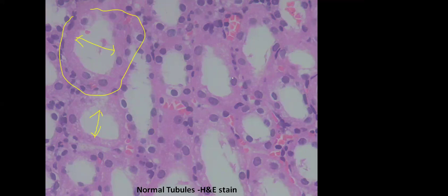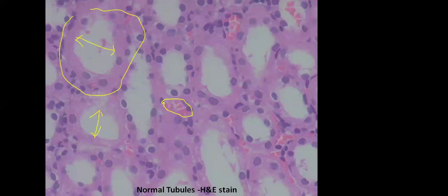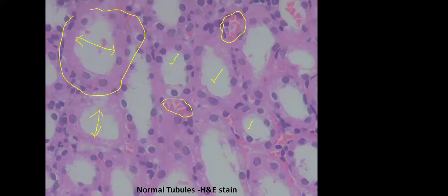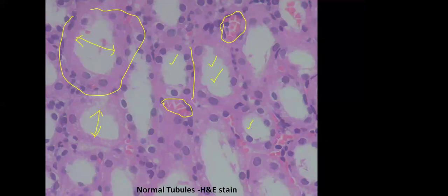If you look at these tubules, what you are seeing here is a peritubular capillary with RBCs. These are the tubules, all arranged in a back-to-back manner. When I say back-to-back manner, that means there is no intervening interstitium you can visualize. Whenever there is no intervening interstitium, that means there is no interstitial edema. Whenever there is interstitial edema, that suggests pathology is going on.